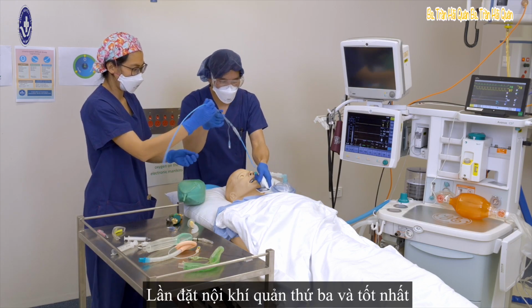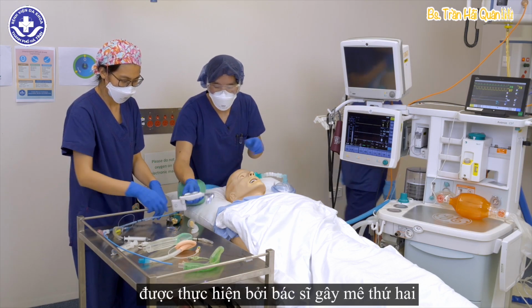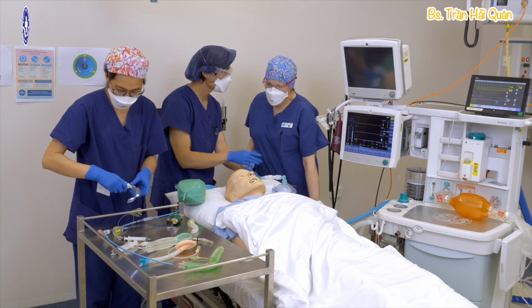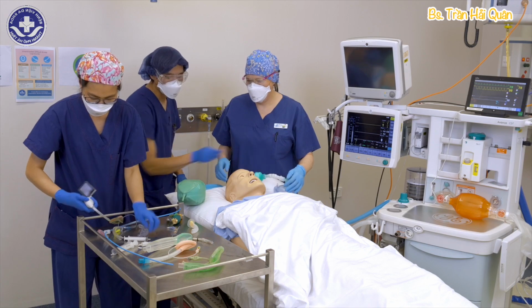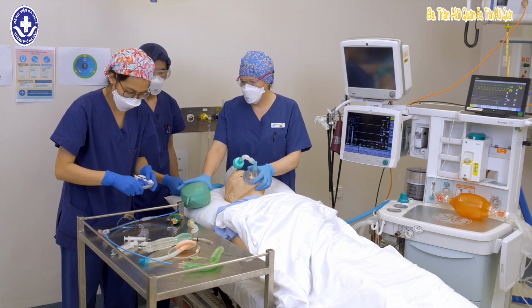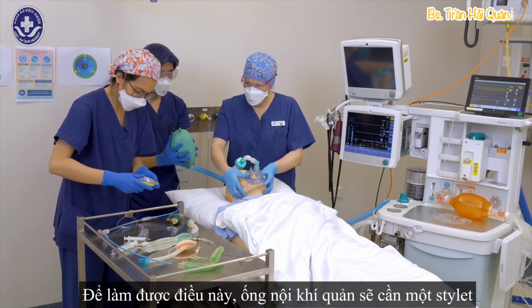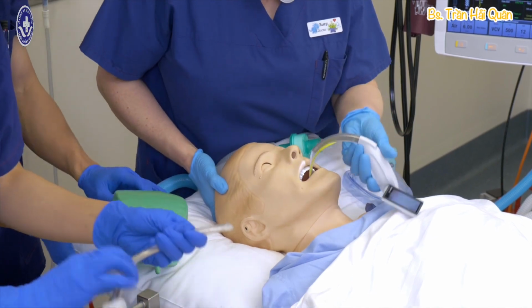A third and best attempt at intubation is made by the second anaesthetist using a hyperangulated blade. To do this, an endotracheal tube will require a stellette shaped in a hyperangulated shape.